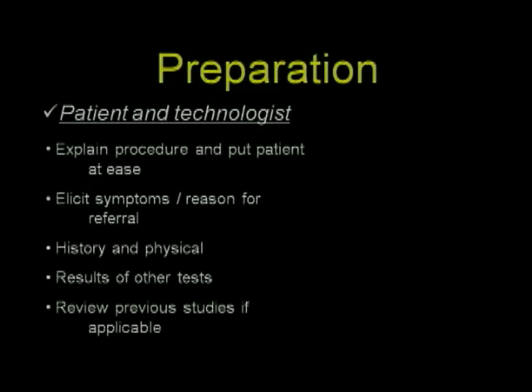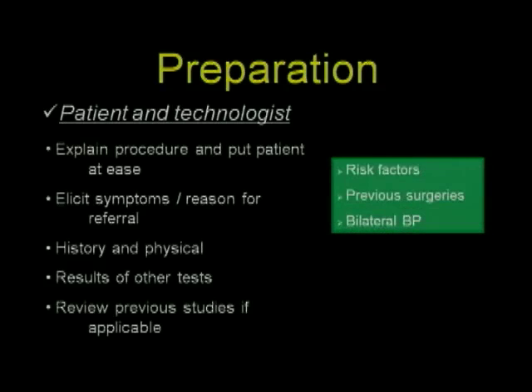I do believe it's important to elicit the symptoms and/or the reason for the referral. Many times this can point you in the direction of the vessel that's referable to the patient's symptoms and is quite important in terms of the presence of subtle findings that could be responsible for symptoms that you wouldn't want to miss. Brief history and physical is in order.